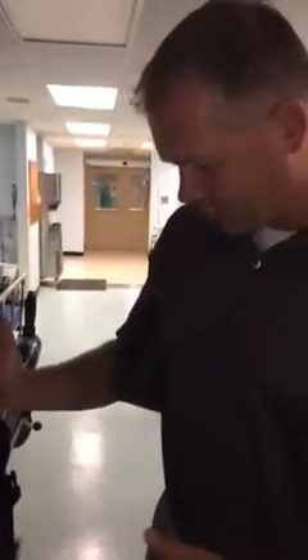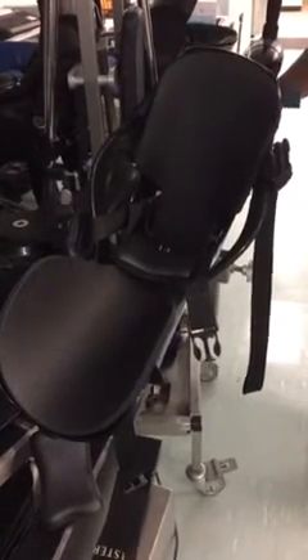Hey guys, this is the Steris OrthoVision — I believe it's the 1100 distraction system. And as you can see, it's going to be very similar to most of the other ones that you're familiar with.